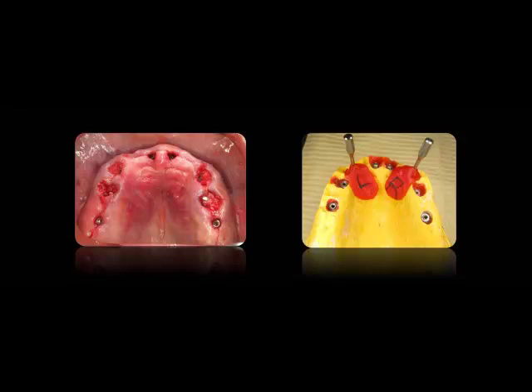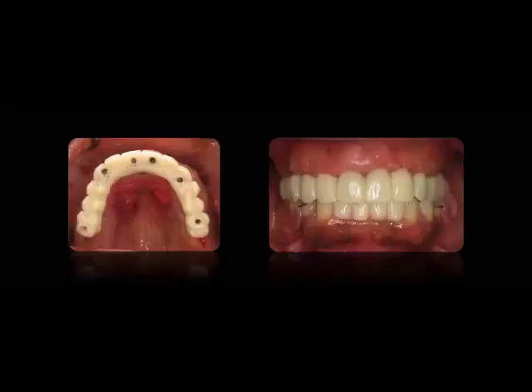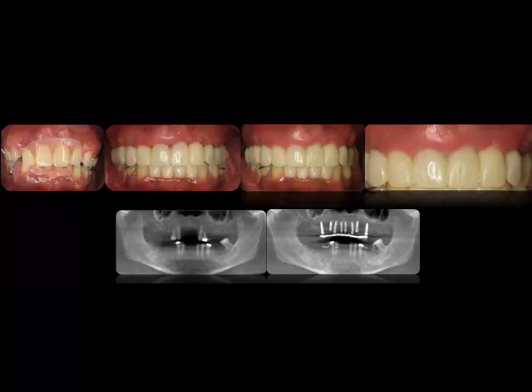We have our jigs fabricated here to help position the implants in the best location, as Dr. Weber discussed. We have to always look at where we want it to be prosthetically. So you can see here that the implants are all placed exactly where we want them to be with an extraction case. And then he leaves, this is immediately after surgery, this is his prosthesis that he leaves with. So he started off here, this is immediately after surgery, this is 1 week post-op healing, and you see up close how the papilla is starting to form into the embrasure spaces. So someone who's embarrassed to smile because he has a horrible prosthesis, now with this high smile line can even have his own soft tissue to replace his smile.